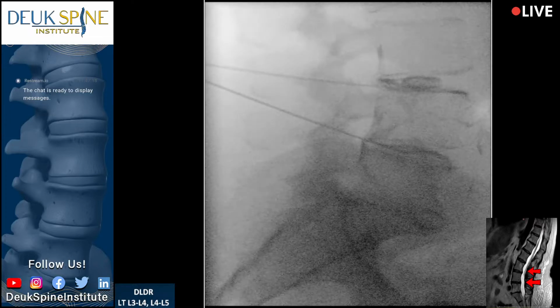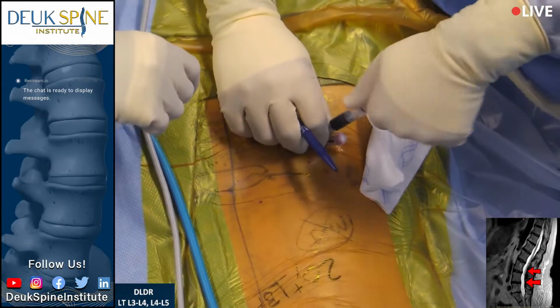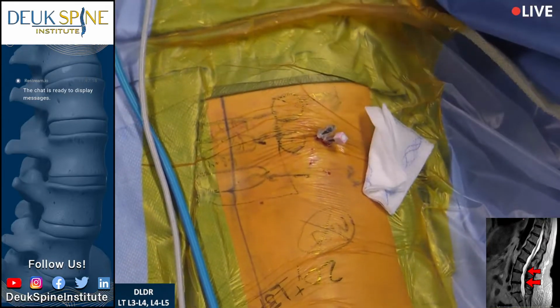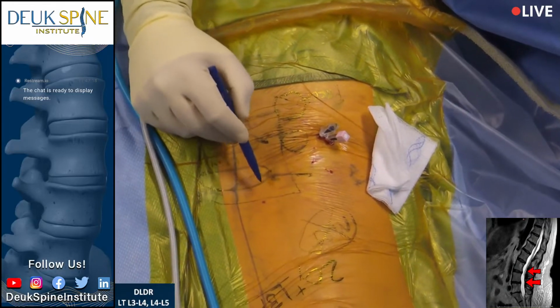How bad is that on a scale of 1 to 10 right there? That was a 10. All right. Is that where you typically get your back pain? Yes. Okay. We're going to put you to sleep, okay? I want you to count from 1 to 100 in German.